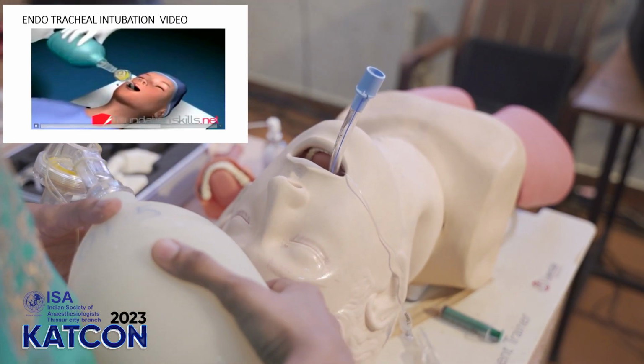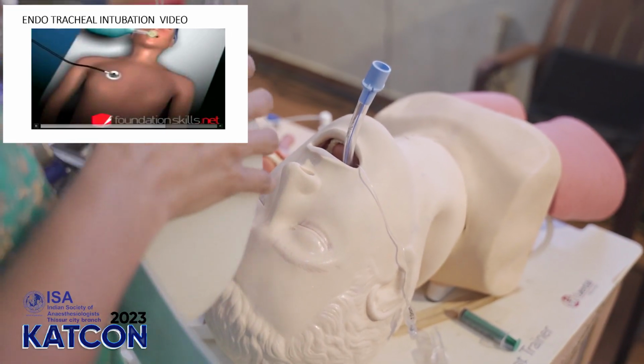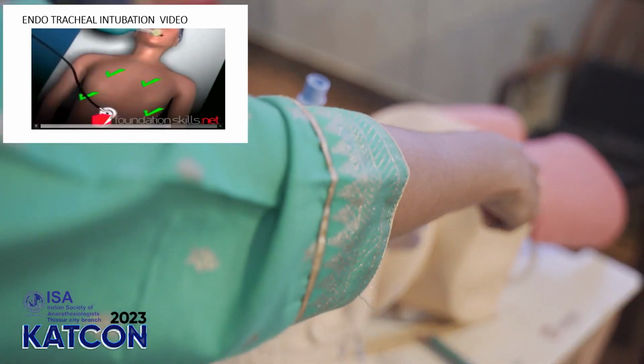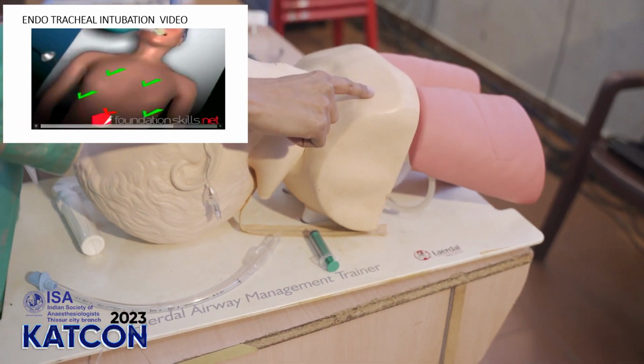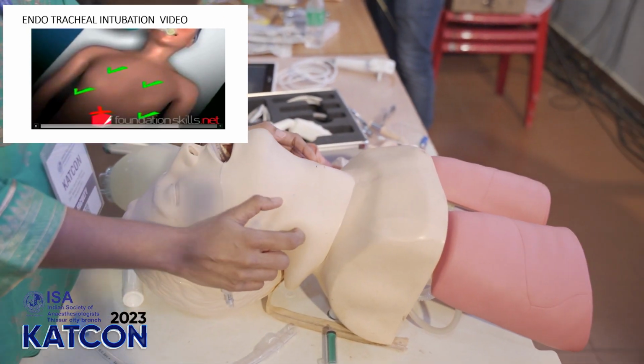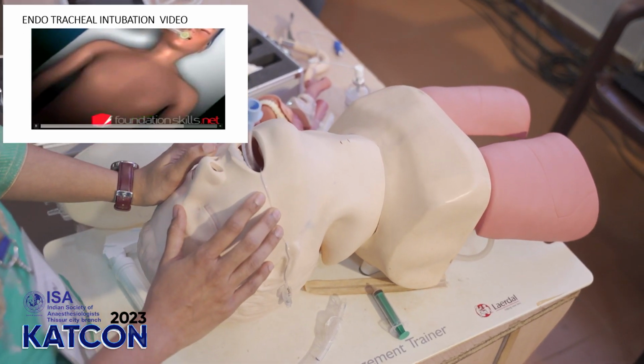Confirm the position of the tube by auscultating over the apices of the lungs, axillae and stomach, to see whether the lungs are getting ventilated or not. For the confirmation, we can auscultate at 5 different points. If it is not in the correct position, deflate the cuff and remove the tube. This red mark, at this point, we can't hear any sound. Resort back to bag and mask ventilation ideally, and repeat the intubation process from the beginning.